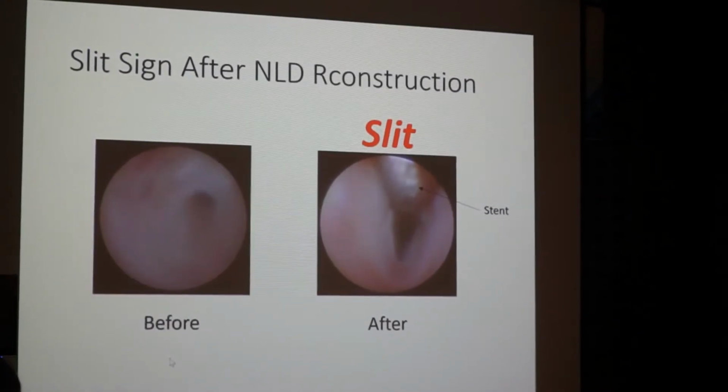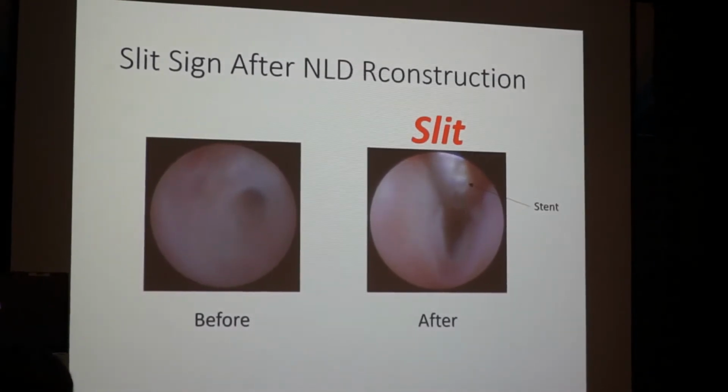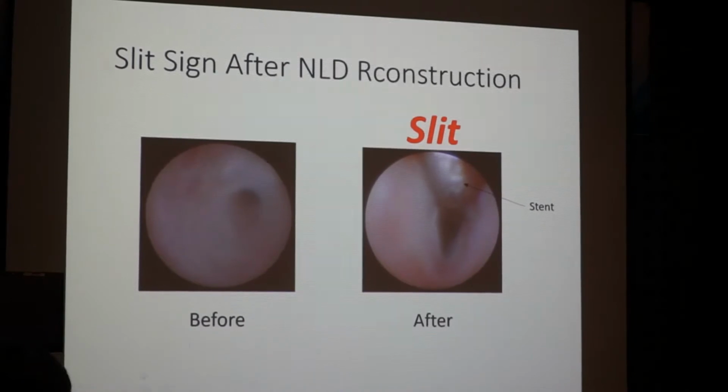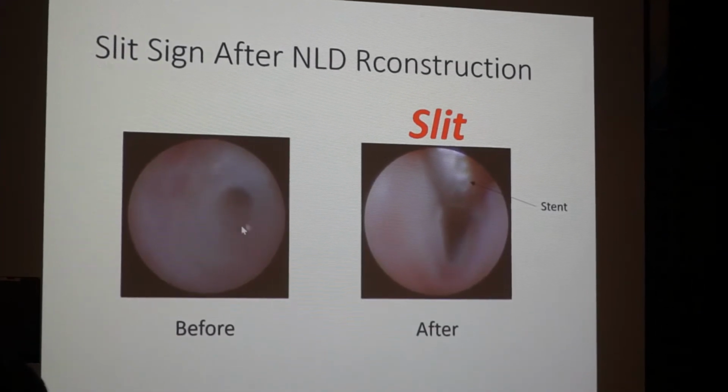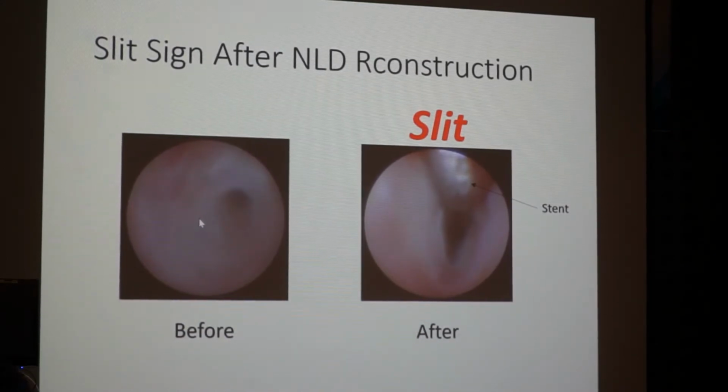Look at this example. The pre-op diagnosis was nasolacrimal duct obstruction. The left side shows the pre-operative endoscope image. You can see a pinhole-like finding here, but the syringing test shows no patency. So this is nasolacrimal duct obstruction. The pinhole is something like an entrance of the fibrous tissue here.